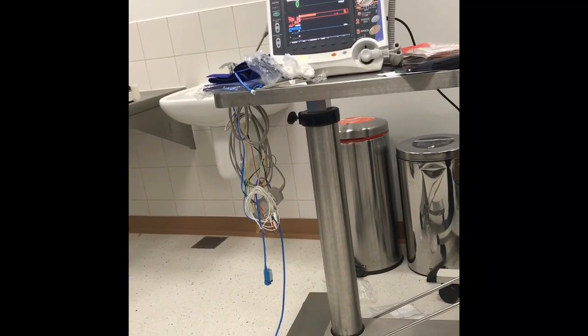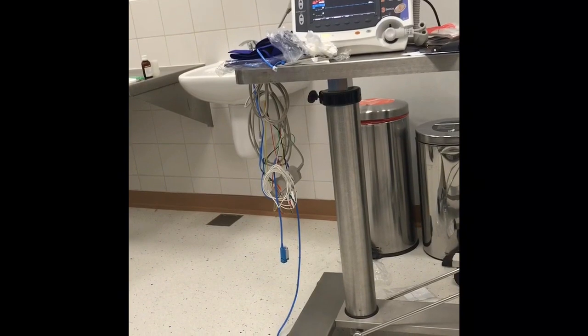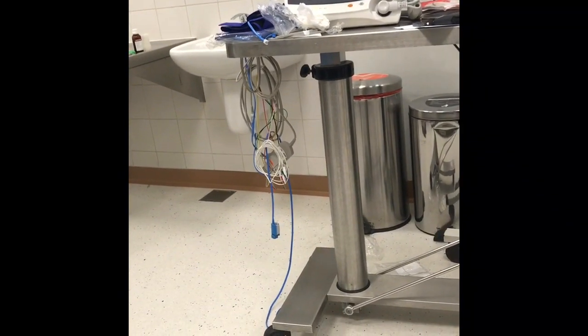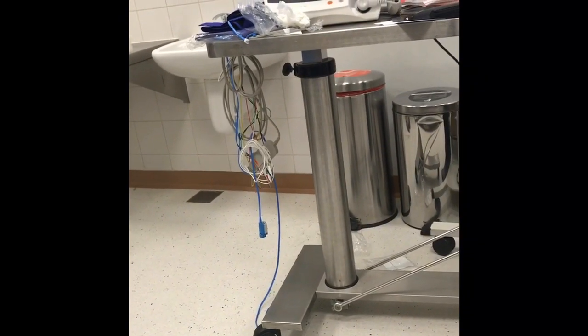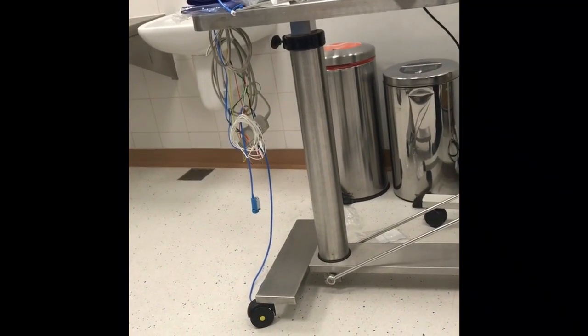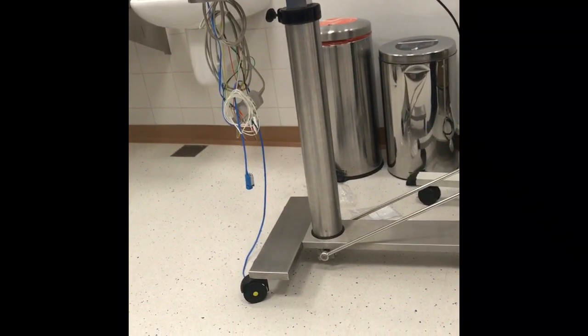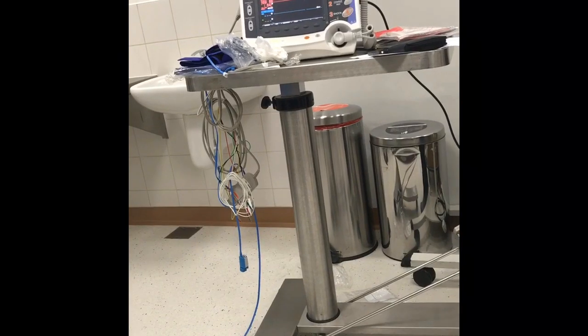Example, I'm using AED pads. I don't have the shock. In the AED pads, I don't have a button to discharge. So I can use this arm. In open heart surgery, I even have a spoon. You know the spoon? Now the doctor doesn't need this energy, so he will ask the nurse to disarm, and she can disarm from the machine. So this is the purpose of this thing.